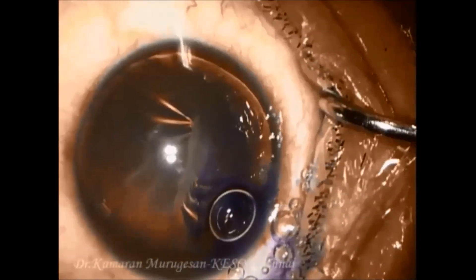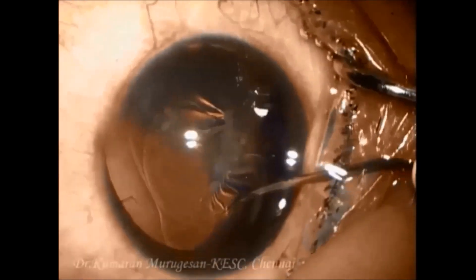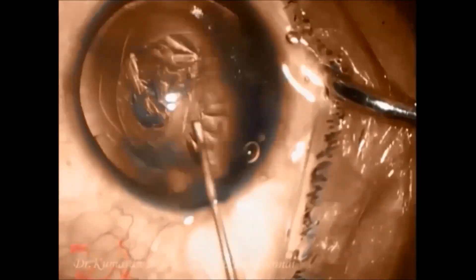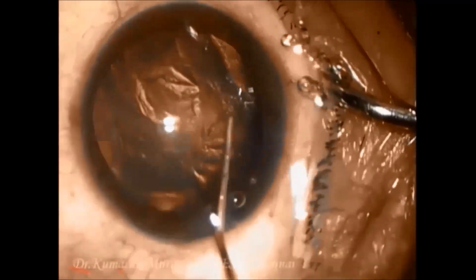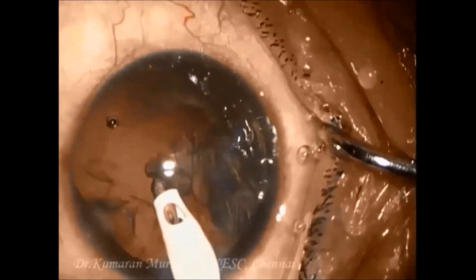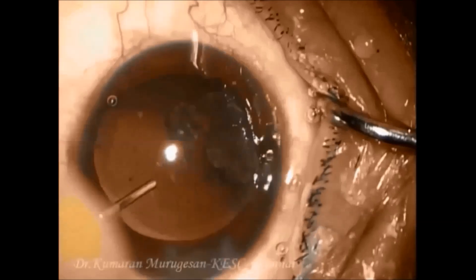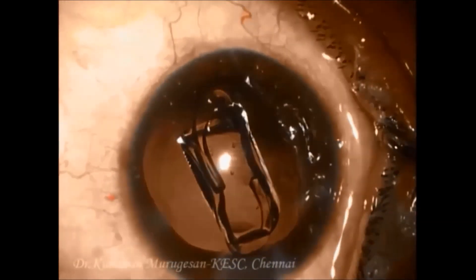Performing the surgery under topical anesthesia solves the problem of centration to a certain extent. Multiple technologies are now available in the microscope to mark the patient's visual axis using coaxial illumination and image superimposition during surgery. Here, I demonstrate a simple technique using the Purkinje images to center the presbyopic IOL on the patient's visual axis.